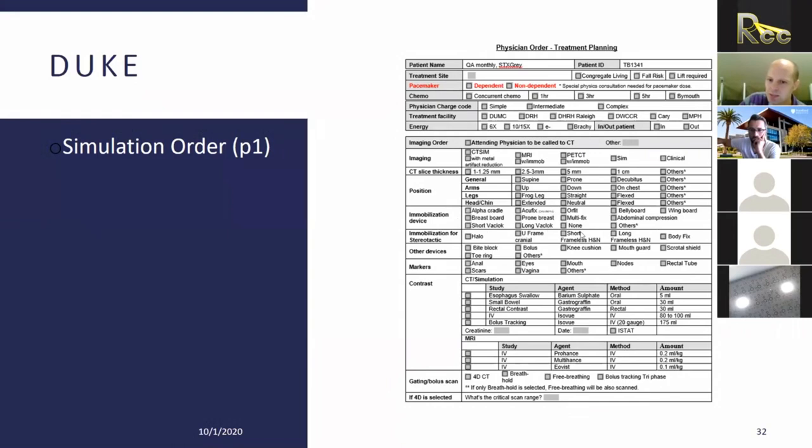And obviously this is something that would change with what's being used in the clinic. So this is a set that we're using, but that could be different, and so on and so forth. And then what markers should be used, information about the contrast, and information about the CT as far as motion management goes.